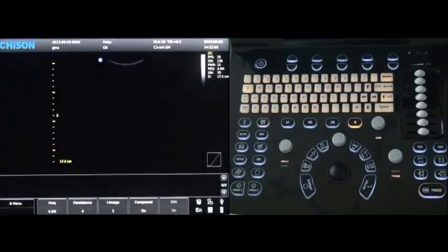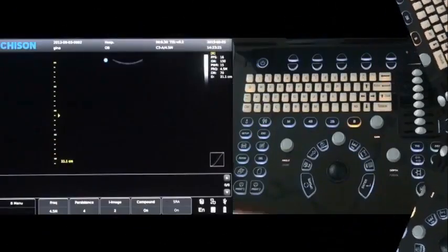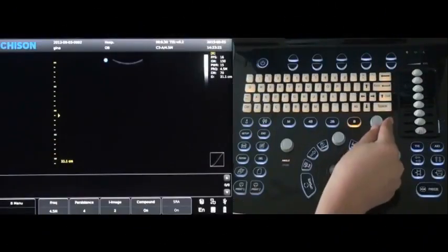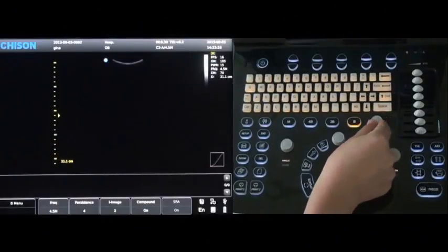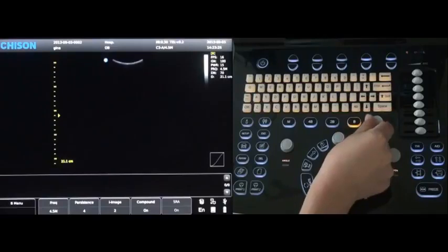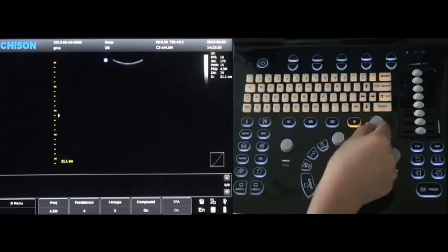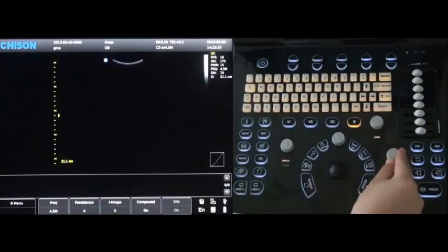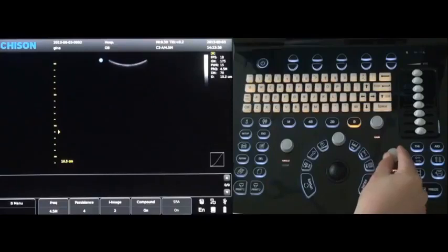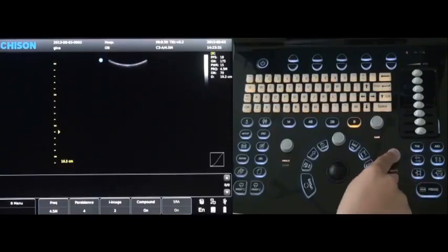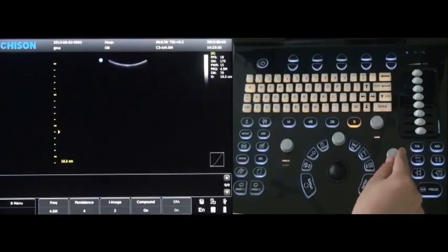B mode scanning and adjustment. Rotate the B key to change the gain of the image. Rotate the key to change the depth. Press this key to change the focus.